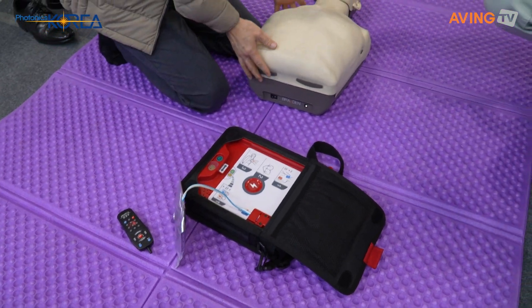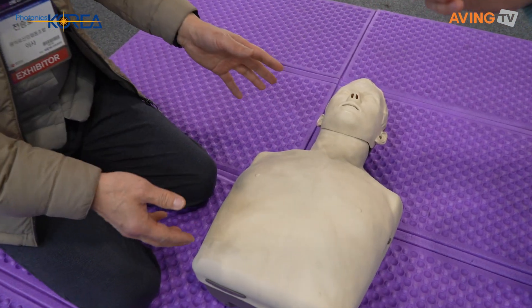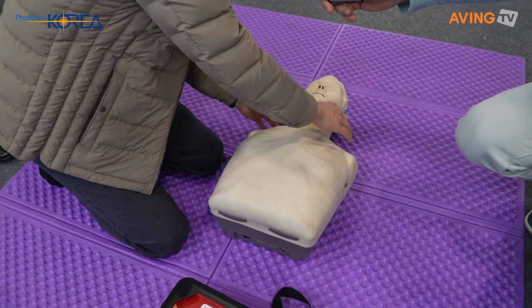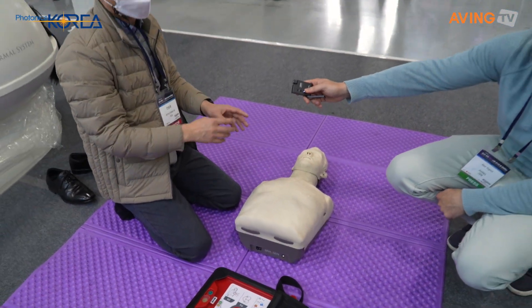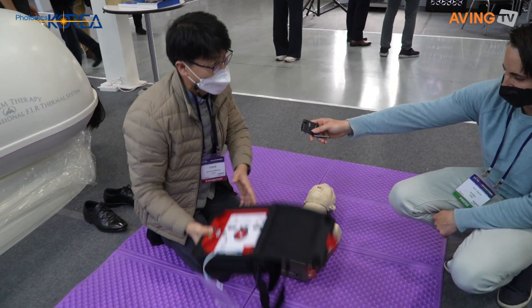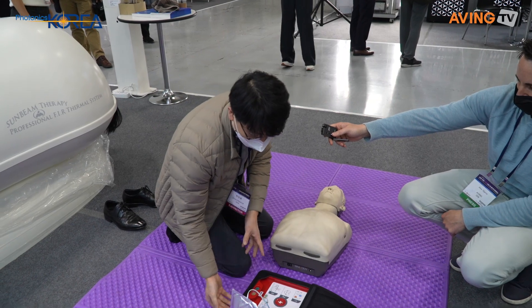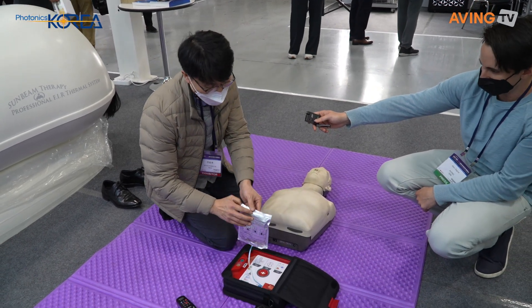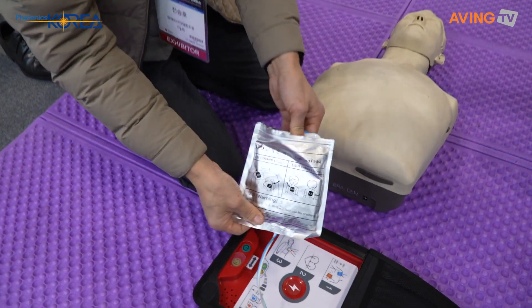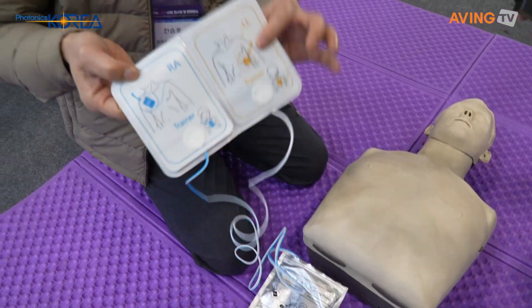When you find a cardiac arrest patient, you take the tab and check the patient status. Then call for EMS. You take out the AED. You can find the pad inside. Open the pad. You can find the two pads.